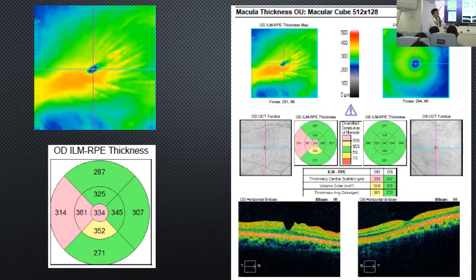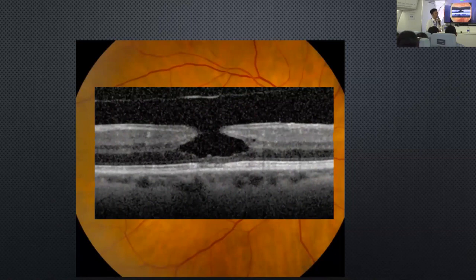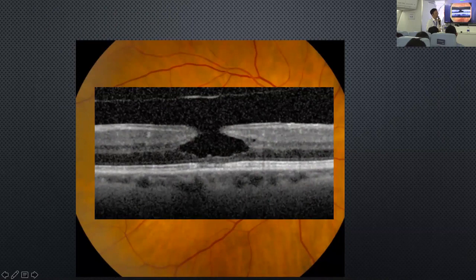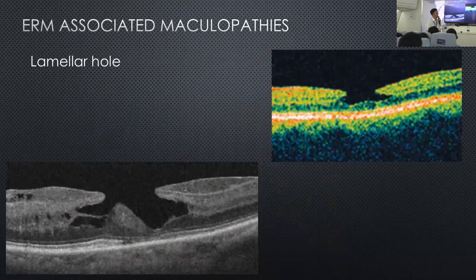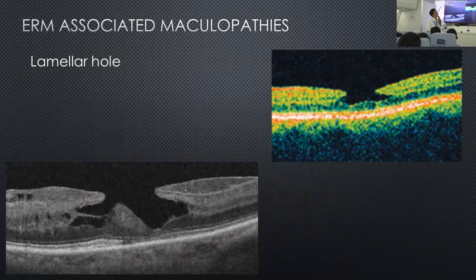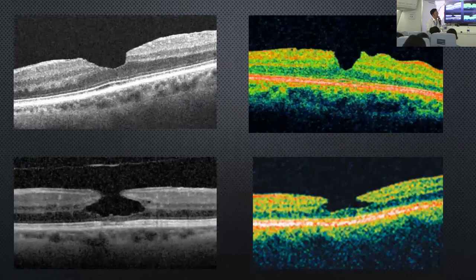Here are more examples of the same. It is caused usually by the presence of epiretinal membrane. A lamellar hole typically shows significant thinning of the macula with splitting of the retinal layer. Some of these can look very odd and have strange appearances. Here are more examples of lamellar macular hole and pseudo macular hole.